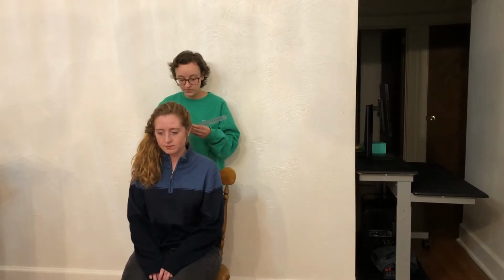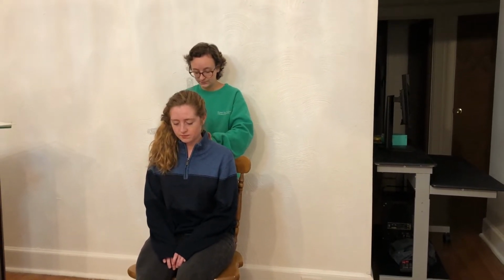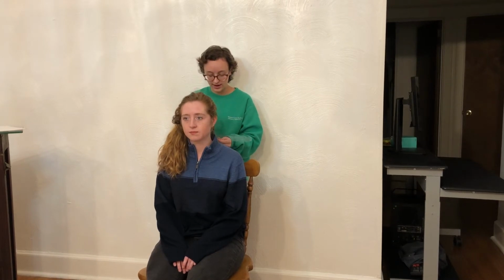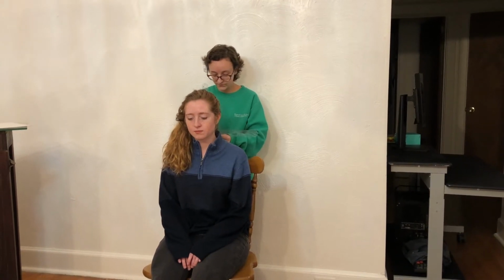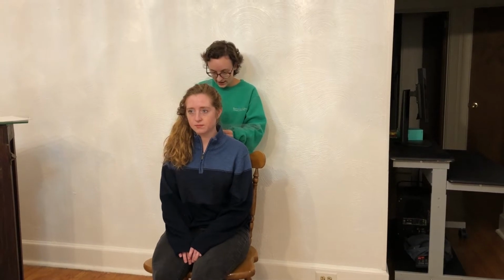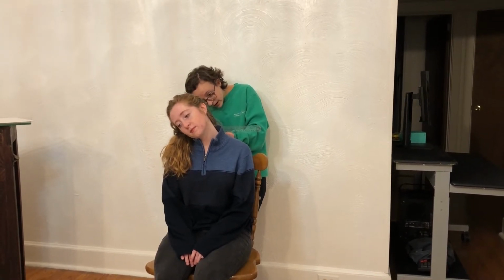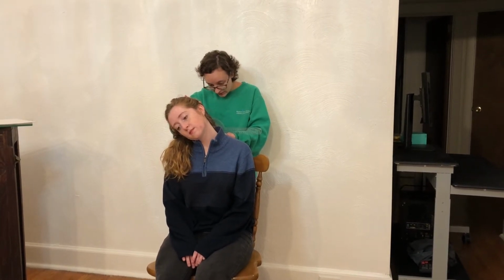Next, I'm going to do lateral flexion. So I'm going to find my patient's spinous process, or the spinous process of C7. And I'm going to go ahead and line up the stationary arm with my patient's shoulder. Okay, so go ahead and bring your right ear to your right shoulder. Okay, so we got about 42. I'm just going to see if I can take you just a little more passively.